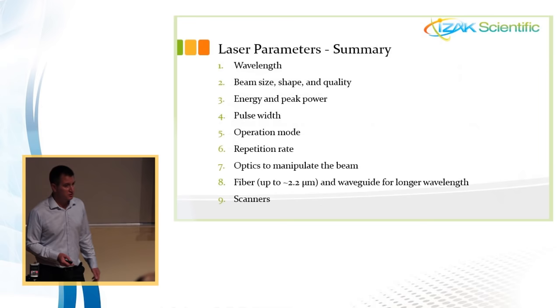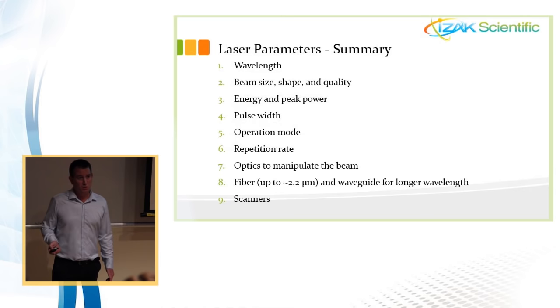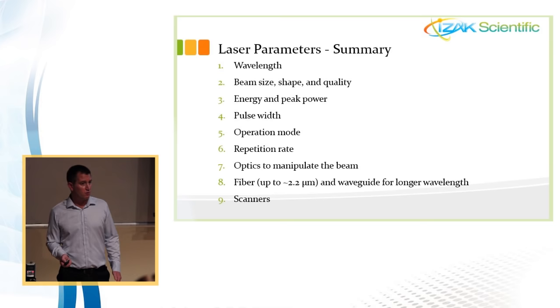Now, when we want to use a laser, we should take into account the parameters of the laser, which are wavelength, beam size, energy and peak power, how to guide the light, a scanner, and operation mode: if it's continuous, pulsed, or ultra pulsed, if it's one pulse and then release, or building up heat pulse after pulse, all of it.